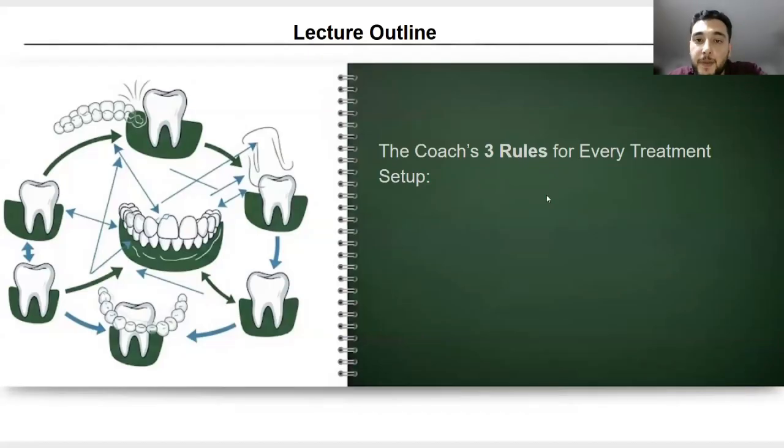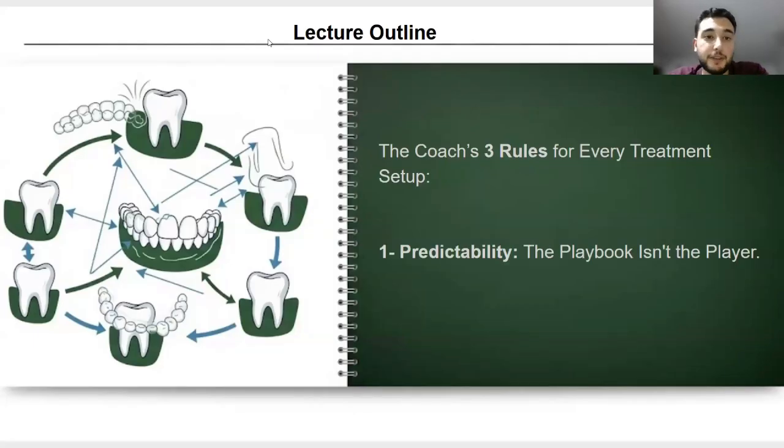So for the lecture outline, I have the coach's 3 rules for every treatment setup. First of all is predictability. So the playbook, we need to understand that the playbook isn't always the player.